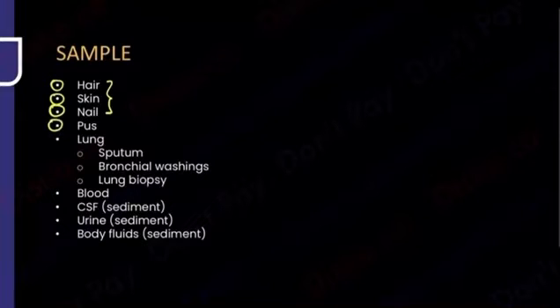Fungal infections can come to you with pus. So maybe they've given you a pus sample, a few ml of pus has come to you for examination. Lung is a very common site. So if there is a pulmonary involvement, the most common sample that I'm expecting is sputum. If sputum is not available, they might have given me bronchial washings or a bronchoalveolar lavage.